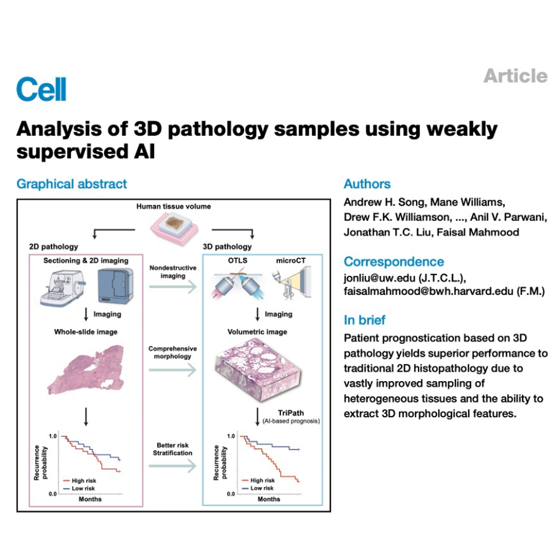0.860. How does that compare? Well, it was significantly better, statistically speaking, than the baseline of just analyzing representative 2D planes from the same volume, which got an AUC of 0.816. So, a clear win for 3D again. A clear win. And the authors argued this boost comes from 2 things. One, obviously analyzing vastly more tissue, but two, capturing those genuinely 3D features you just can't perceive in 2D slices.